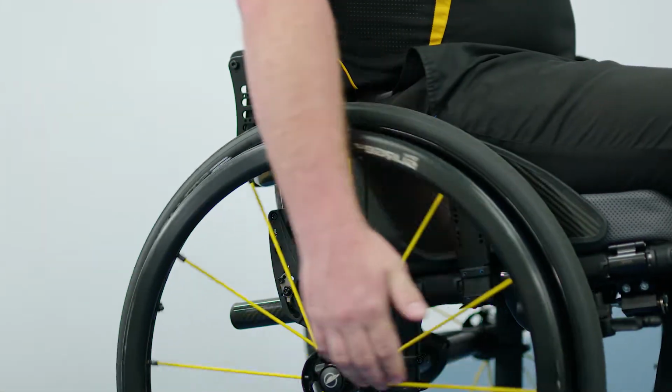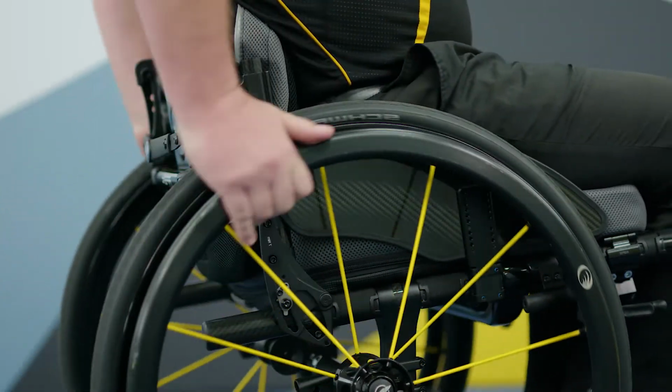Users of wheelchairs typically engage in multiple activities during the day. This includes manual lifts for pressure relief, self-propelling depending on distances accessed, and participation in daily activities, which may include shopping or community activities. With this exposure to multiple activities, there is a high risk of injury to the upper limb due to frequent use. We're therefore going to look at the relationship between maneuverability and stability of wheelchairs and how we can optimally configure wheelchairs to better manage upper limb injuries.